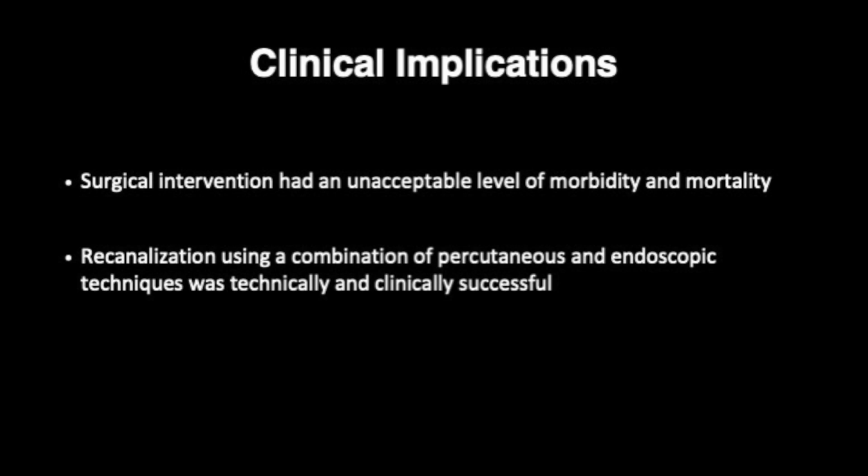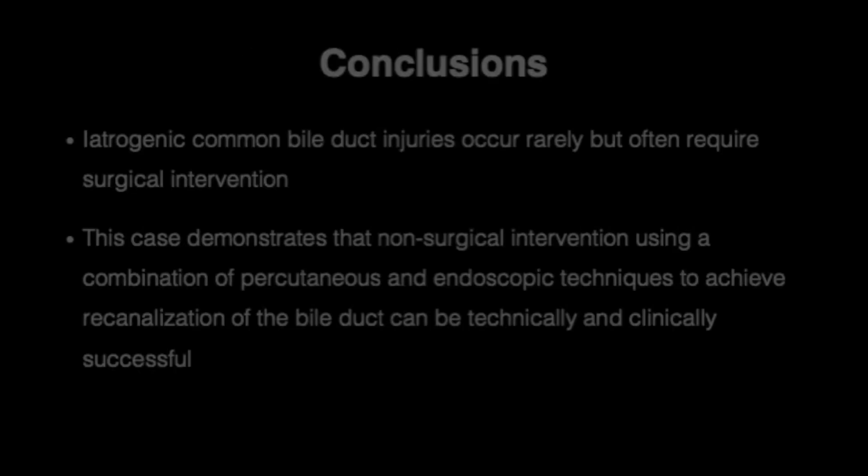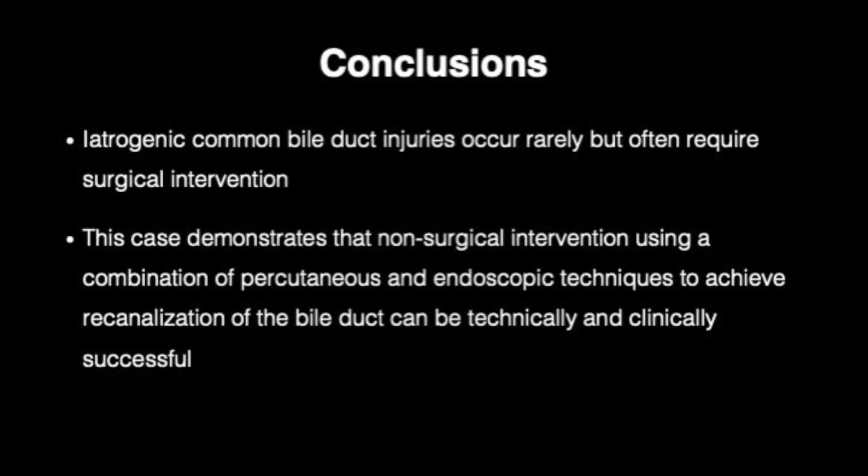In this case, we were able to avoid surgical intervention, which carried a substantial level of morbidity and mortality. Furthermore, we were able to avoid long-term percutaneous drainage, which was also felt to be an undesirable outcome for this patient. Recanalization of the biliary tree using a multidisciplinary approach was technically and clinically successful for our patient. Iatrogenic common bile duct injuries occur rarely but often require surgical intervention. Our case demonstrates that non-surgical intervention may be feasible in select cases to achieve recanalization of the bile duct.